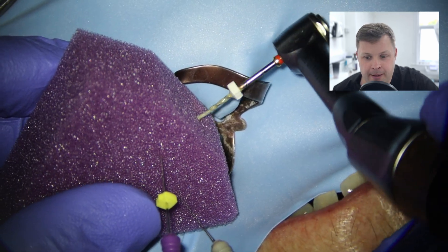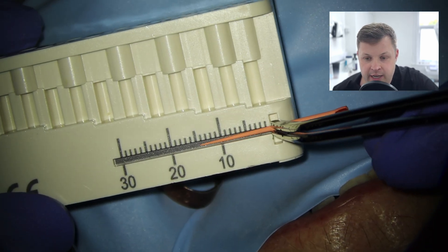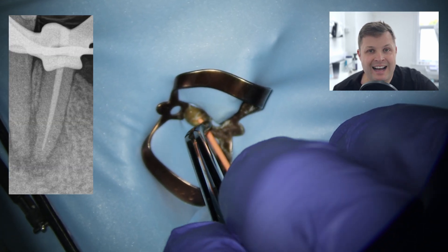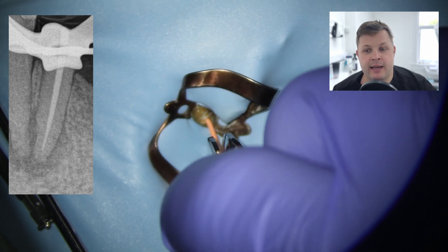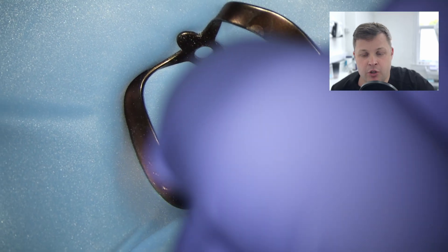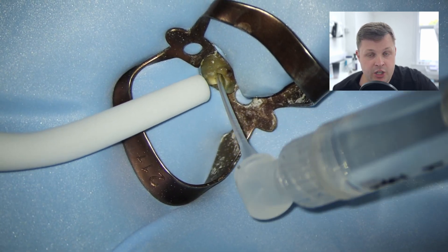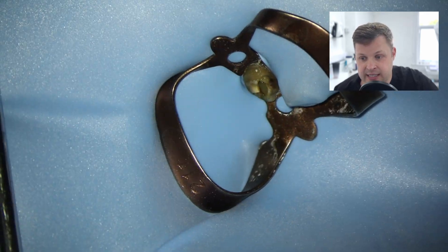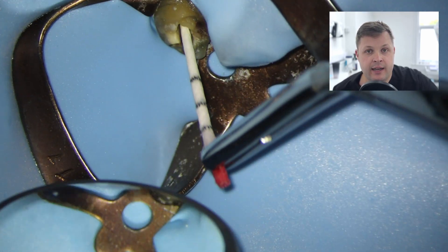We're ready for the cone fit radiograph using the matched cone. Looking at the radiograph, although it appears short of the working length, I'm happy it's correct — as I've covered in many videos, the radiographic apex and the anatomical apex are not necessarily the same thing. For the final irrigation protocol, I remove the GP, use sodium hypochlorite at 2% — I use 2% because I use large volumes and don't like higher concentrations — then activated 17% EDTA, back to sodium hypochlorite, reactivation, and then dry the canals.